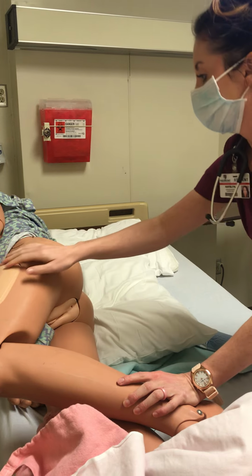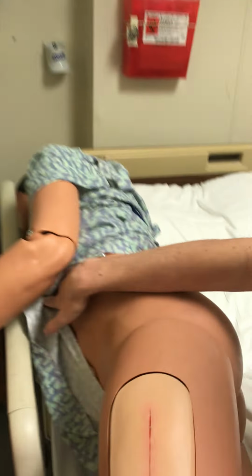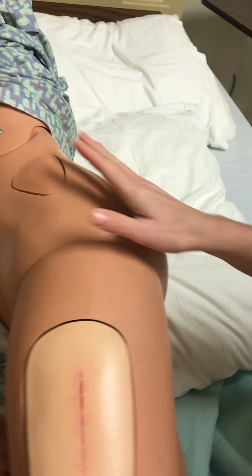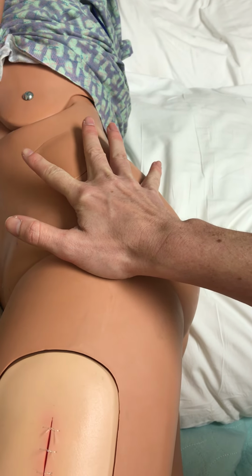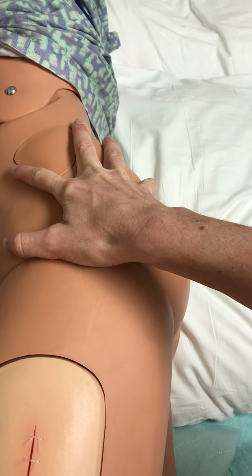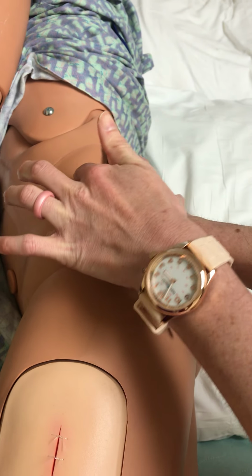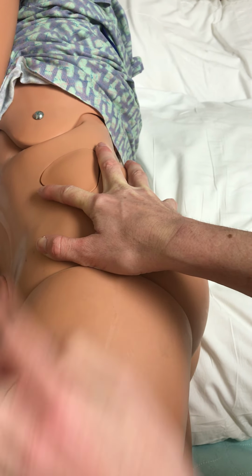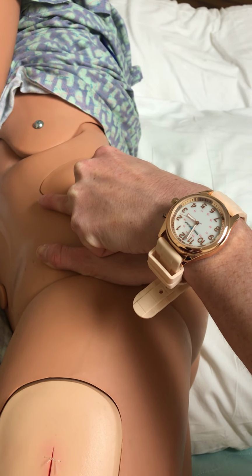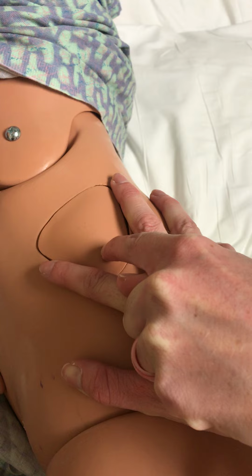All right, Mr. Jones. So now I will be giving this medication here. What I'll be showing you is that I'll be putting the palm of my hand over the greater trochanter with my thumb pointing towards the umbilicus. I would spread my index and middle finger apart, and I would be giving it right here in between the index and middle finger, in between these two knuckles right here.